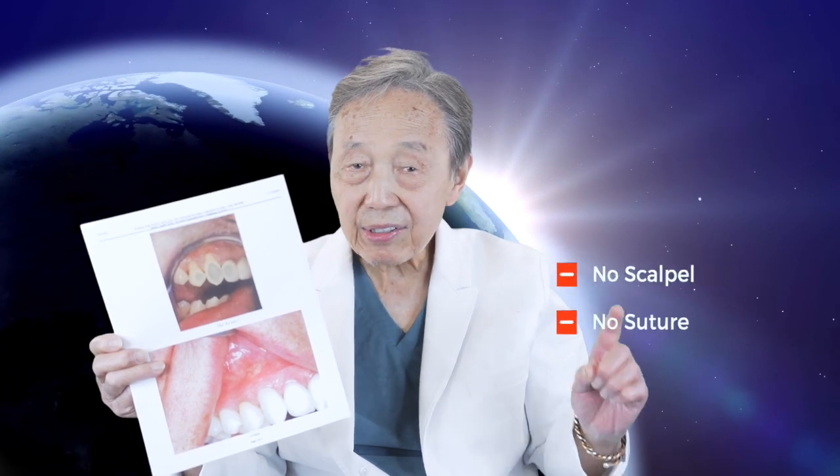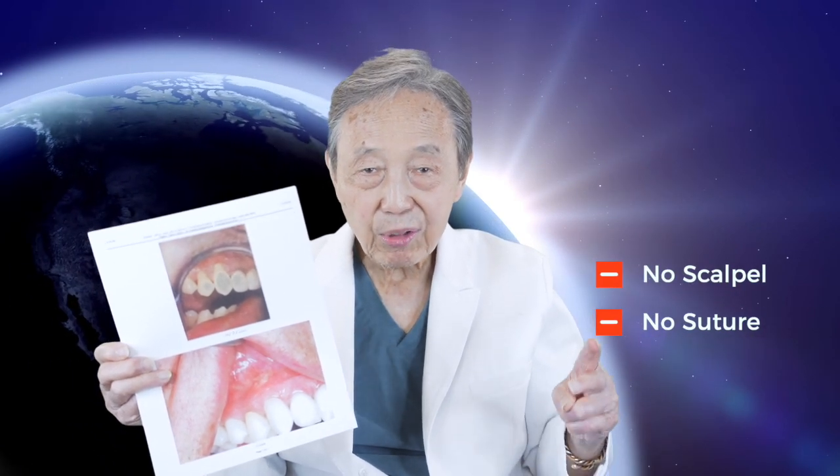This shows you a minimally invasive surgical technique, such as the Pinhole Surgical Technique, that does not require scalpels or sutures. It can produce long-term results, provided you have a great patient.